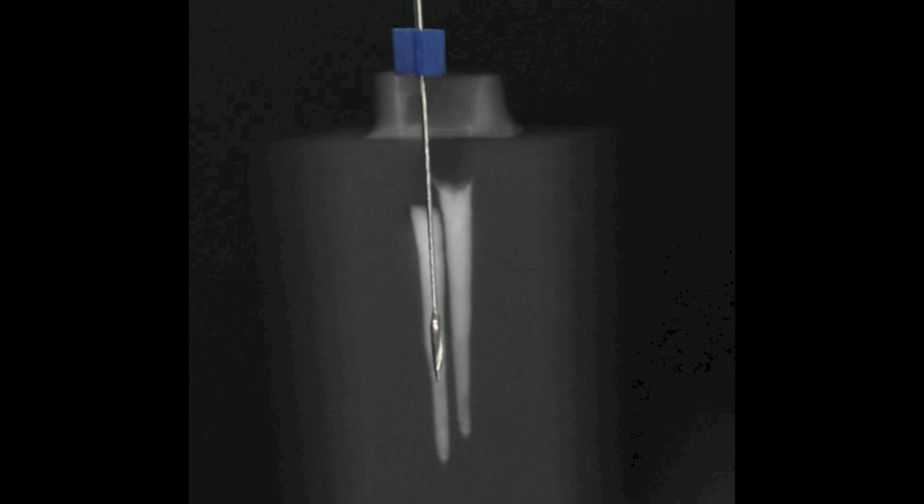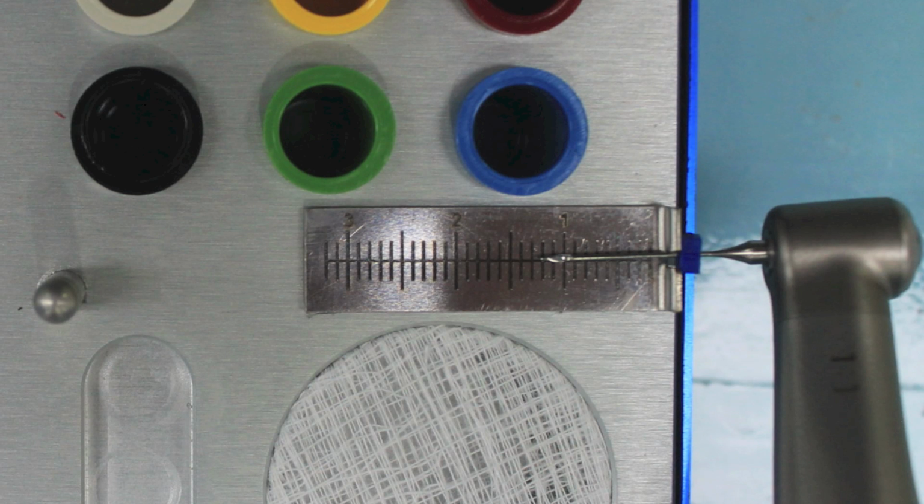A gates glidden is measured against the radiograph to determine the length to which the gates glidden and reamers will be inserted into the canal. Adjust the stopper to a determined reference point coronally. Use this measurement as a guide for gutta-percha removal.